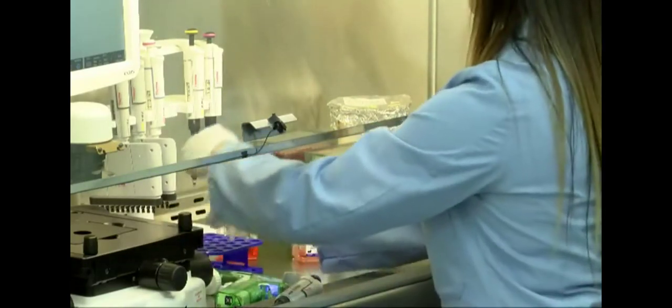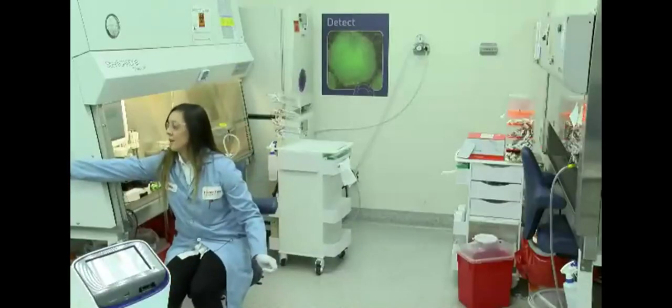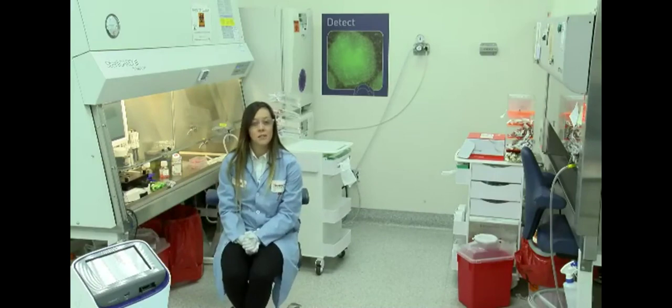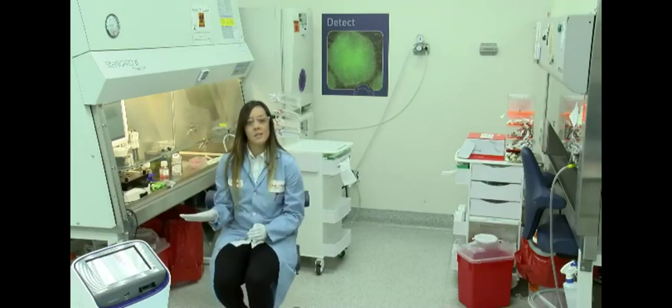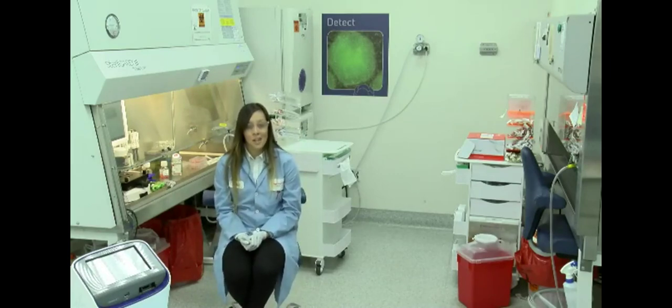So once we add all those, we're actually going to spin our cells down right now. So our cells are going to spin at 300 times g for 5 minutes. So while that's spinning down, this is a good time to talk about our B27 and B27 Plus neuronal culture systems and how they differ.